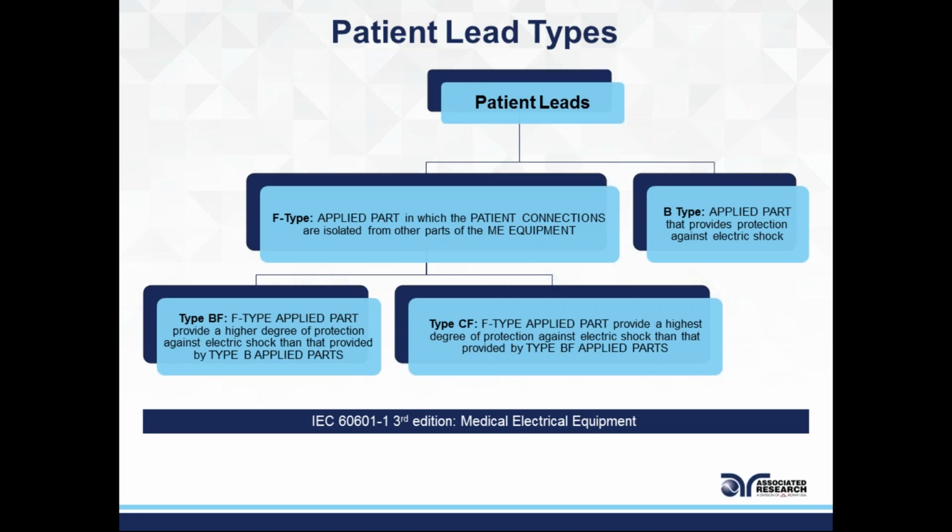Usually there's a basic level of protection provided for shock hazard, and this basic level of protection is usually a grounded surface. So if, for instance, a metal part of the bed is grounded through the line input of the mains conductors, you're officially grounding that product. Once you're grounding a product, you're providing a basic level of protection from any kind of live voltage by grounding the product.